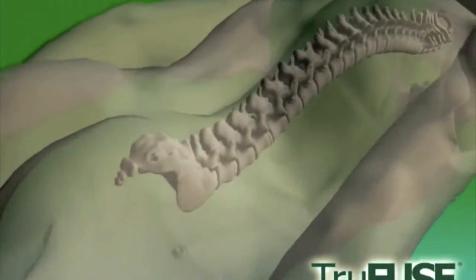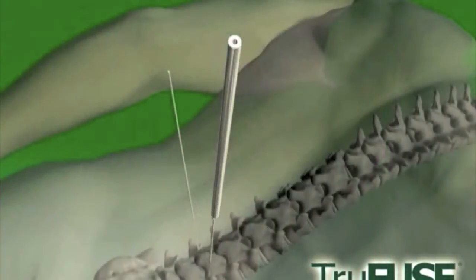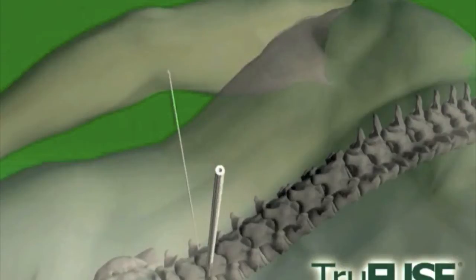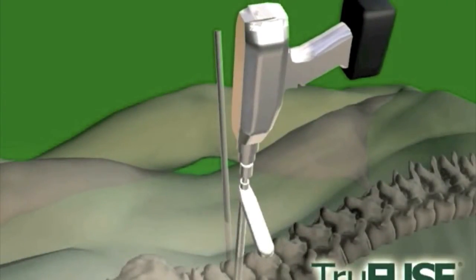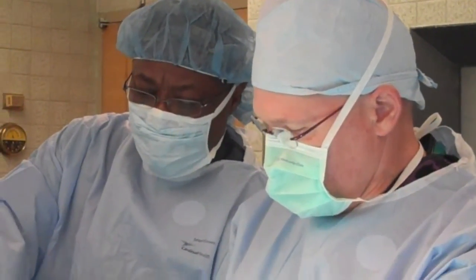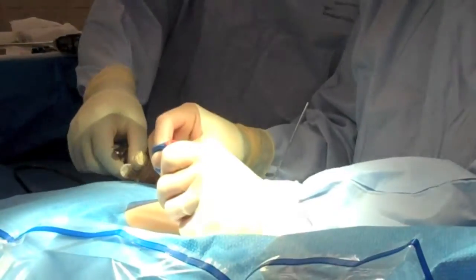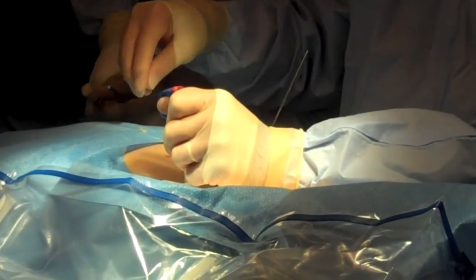It involves drilling a small hole in the middle of the joint and placing a small piece of bone in that cylindrical hole and stabilizing the joint, eventually fusing it. It's a very small incision. It's less than a half inch, generally 2 stitches, and it heals up very quickly. We take the stitches out a few days later.